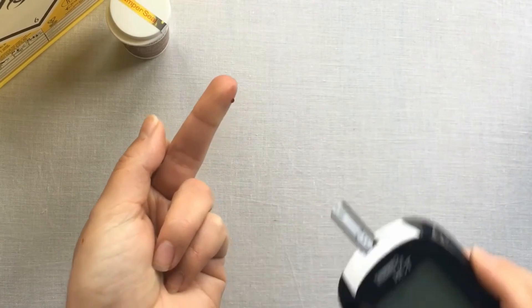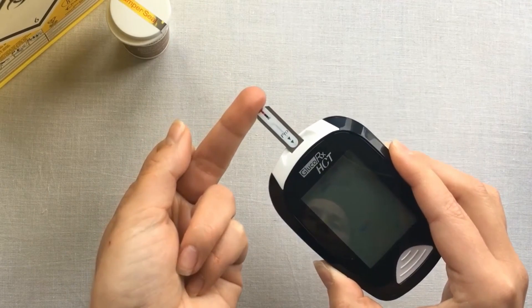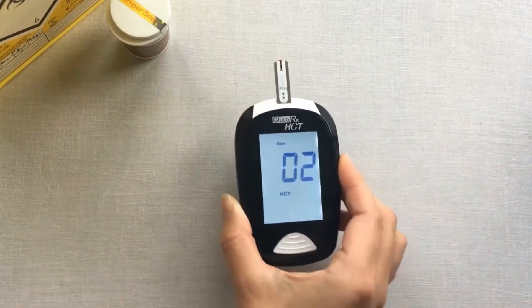Hold the meter and bring the strip to the blood droplet so it touches. It automatically sucks up the blood into the strip.